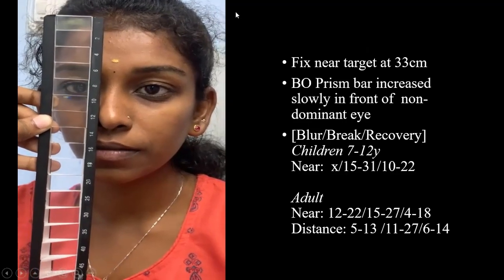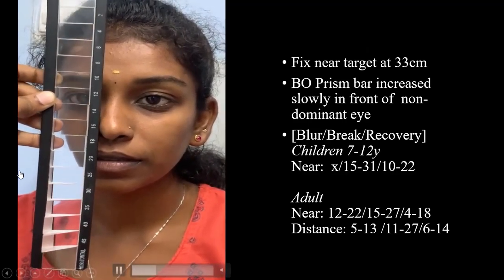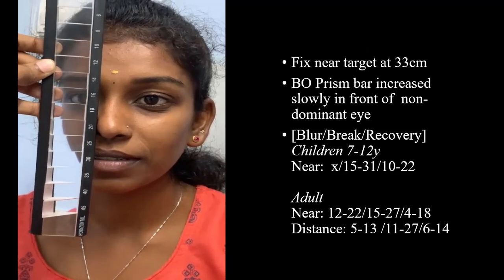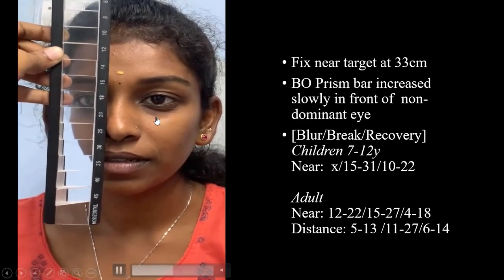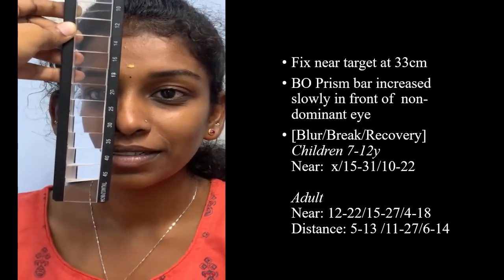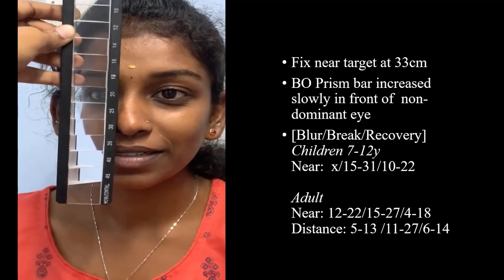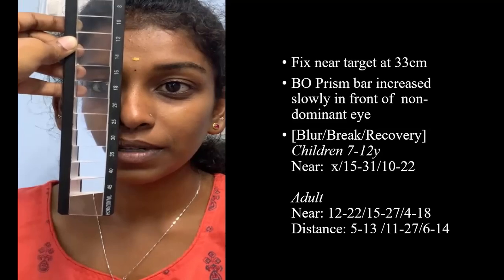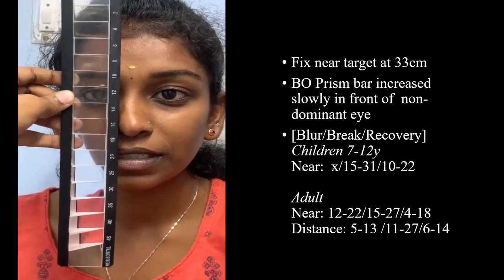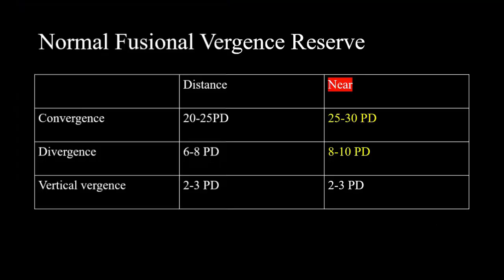Here we can see we are increasing the base out prisms in front of the eye. Subjectively the patient says when they are able to notice double vision, and objectively we can also note in the other eye the recovery movement, the refixation movement. Initially they might be able to fuse a little, so we have to wait till they are seeing sustained blur or sustained diplopia. And we have to reduce it back to find out the recovery point. The normal fusional vergence reserve for near, mostly when we test, for convergence is 25 to 30 prism diopters, and for divergence is 8 to 10 prism diopters.